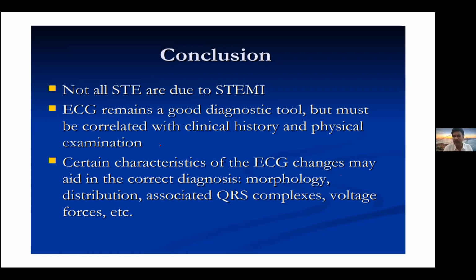The other message is that you should not diagnose ST elevation in every patient because you are panicking the whole community. Not all ST elevation is due to ST elevation MI. There are several reasons for it, like pericarditis, early repolarization, LBBB, and LVH. ECG remains a very good diagnostic tool, but it must be correlated with typical chest pain.